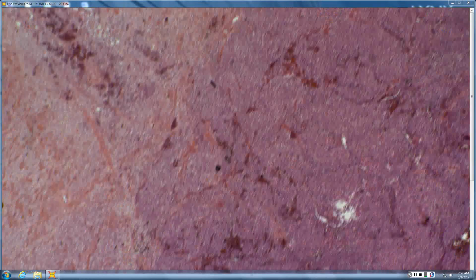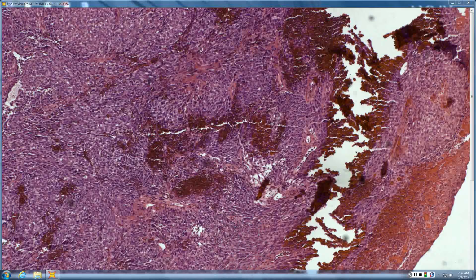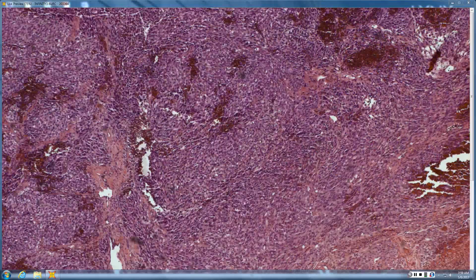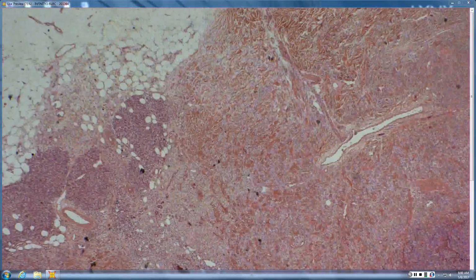So, you have an ulcerated tumor-looking thing here. Yeah, lots of blood vessels and hemorrhage. If you were to characterize the type of cells composing this ulcerated tumor, the morphology of the cells, they look long and skinny. Yeah, long and skinny. I'm worried about angiosarcoma. Yeah, so angiosarcoma with all the blood, and then long and skinny, the other way to handle this would be spindle cell tumor. So angiosarcoma, reasonable thought at scan.